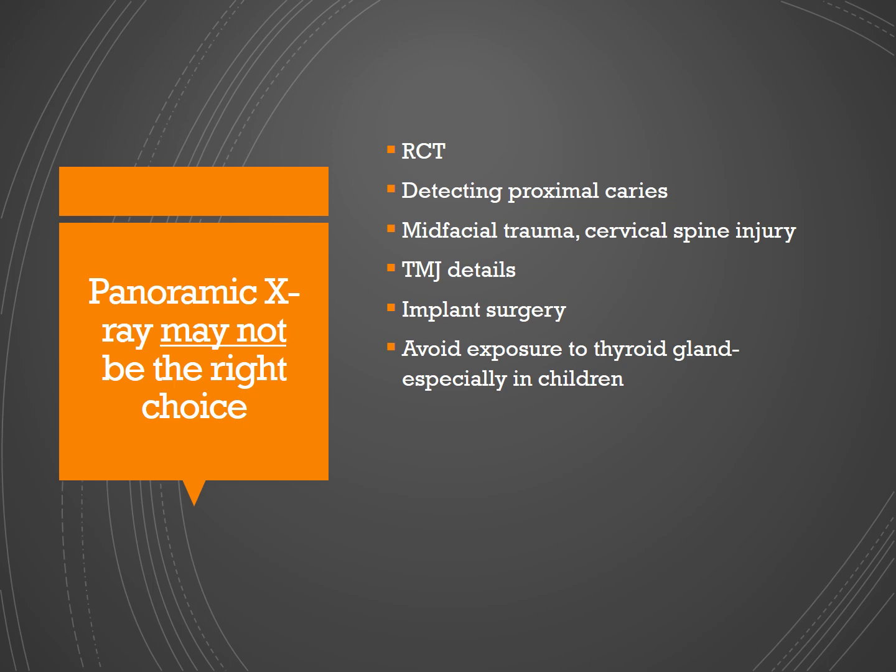Some of these can be replaced or done with an intraoral radiograph, and for the others you might require a CBCT or a CT scan to visualize the details.